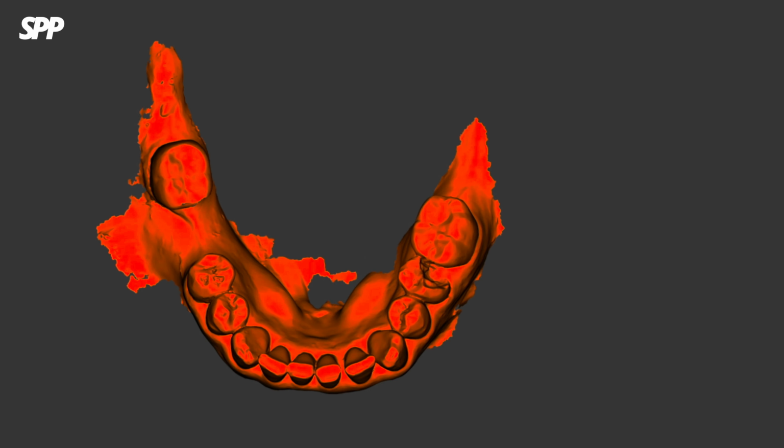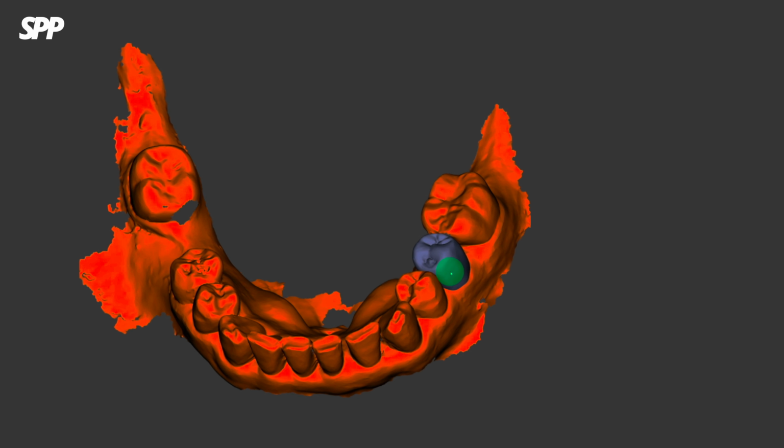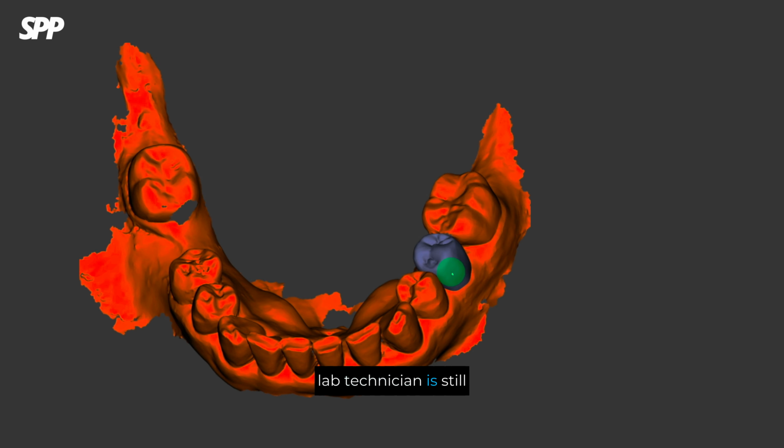An implant was placed immediately after extraction, and the provisional prosthesis was delivered on the same day. In the planning software, I can perform a virtual extraction. After that, a virtual wax-up can be created. Based on this design, the crown can be 3D printed and prepared before surgery. For the final prosthesis, the expertise of a lab technician is still essential. However, a provisional restoration can be prepared much more easily. I want to show you how simple and efficient this process can be.